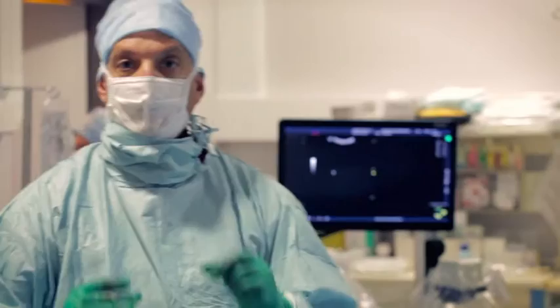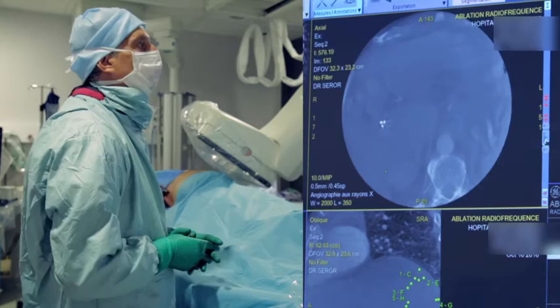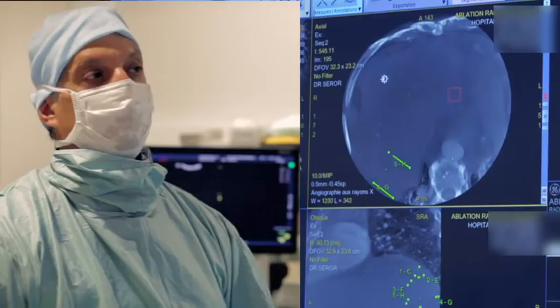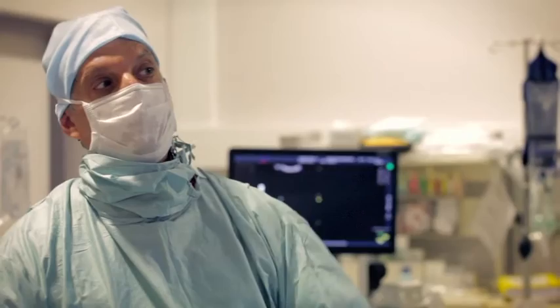All six of our electrodes are highlighted by overlays, and we send all these trajectories into the 3D cone beam CT volume to check on cross-section images that we are in the correct position. The needle that will cause real concern is the one that borders the capsule, seen clearly on the bottom of the image. We can see that it is in the liver, but I was not able to see it with the ultrasound. This is a good example of the usefulness of combining both types of imaging — if I had only used the ultrasound, it would have been wrong for the positioning of the last needle.